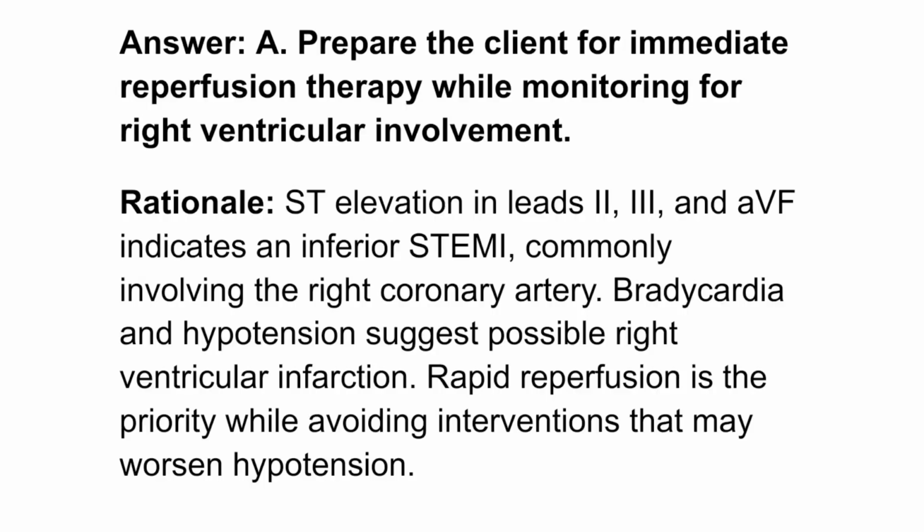Rationale: ST elevation in leads 2, 3, and aVF indicates an inferior STEMI, commonly involving the right coronary artery. Bradycardia and hypotension suggest possible right ventricular infarction. Rapid reperfusion is the priority while avoiding interventions that may worsen hypotension.